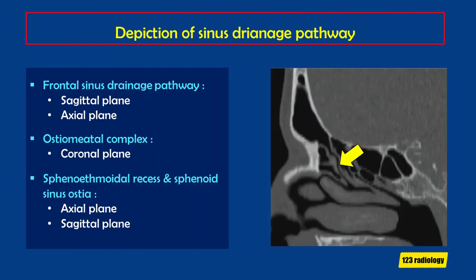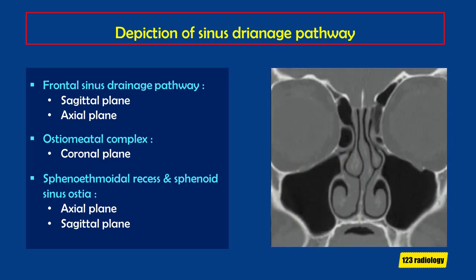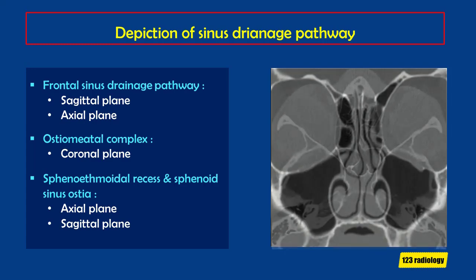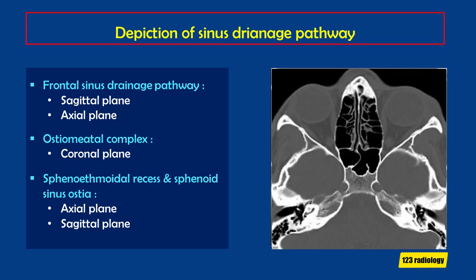The frontal sinus drainage pathway, or the frontal recess, is best depicted on axial and sagittal planes. The ostiomeatal complex is depicted well on the coronal plane. The sphenoethmoidal recess and sphenoid sinus ostia are best seen on axial and sagittal planes.